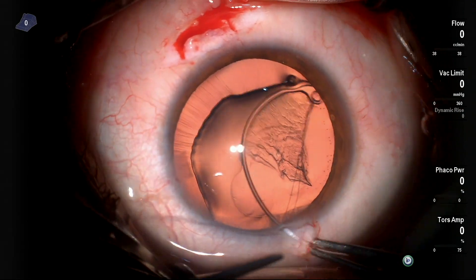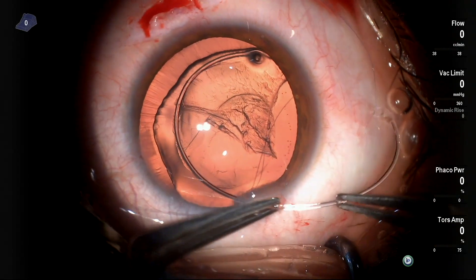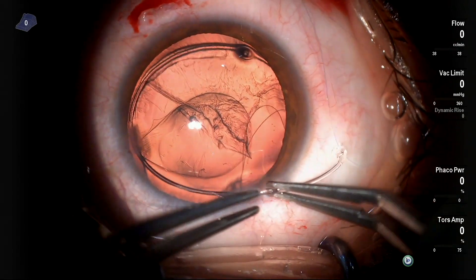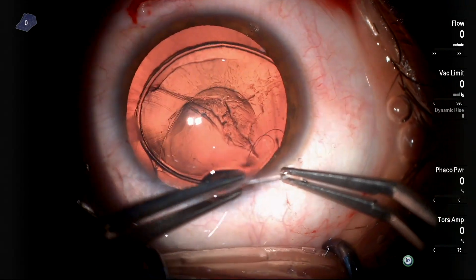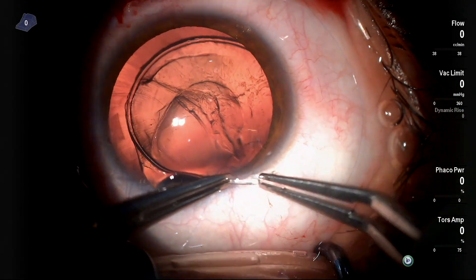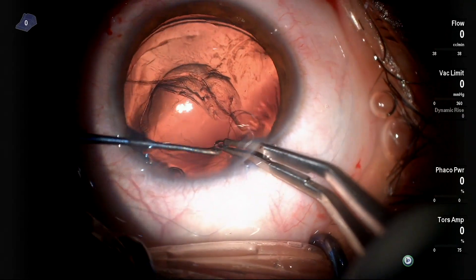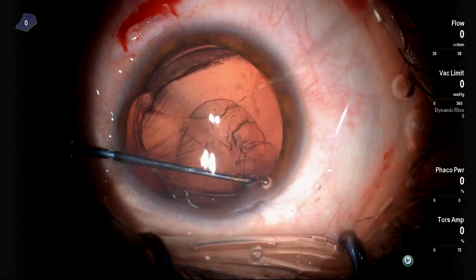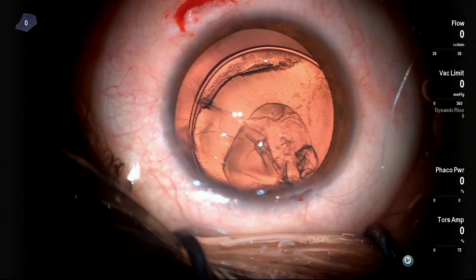Inserting the CTR and pushing against these subluxated zonules is a bit tricky — you have to do it slowly. As you can see, the CTR was inserted and the threads are positioned within. But of course, this capsular tension ring alone is not totally enough to support the capsular bag.